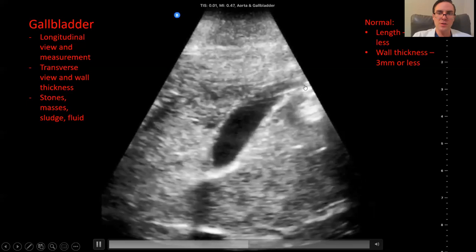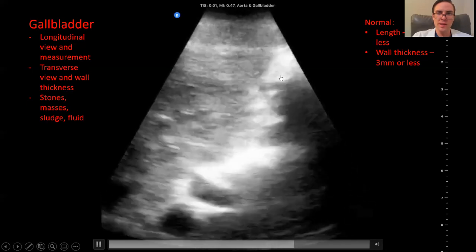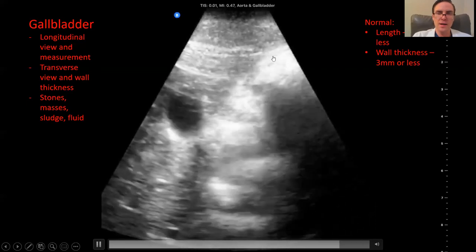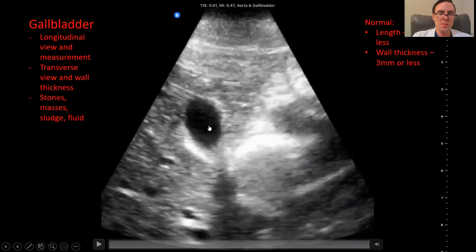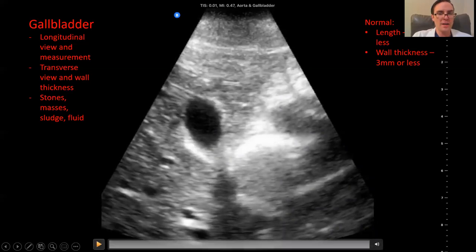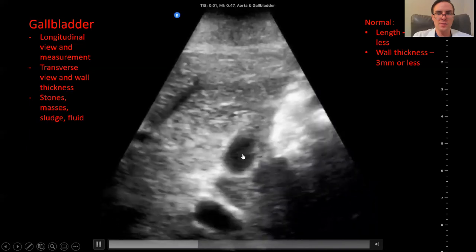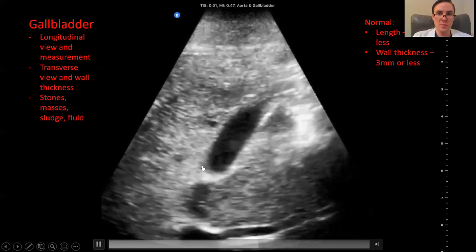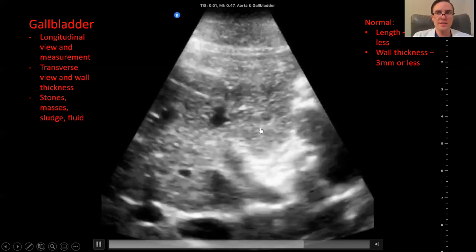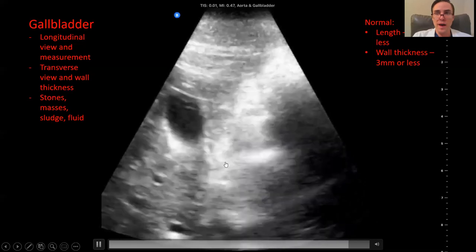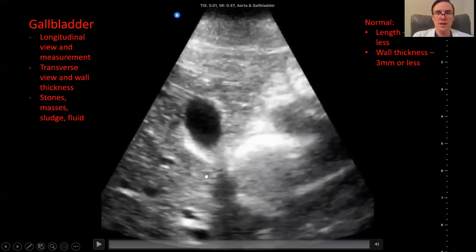The gallbladder is an elongated organ — round on the transverse view and elongated, like a banana, on the longitudinal view. You want to get both measurements. On the transverse view where it looks circular, you can measure the thickness of the wall — you want to make sure it's three millimeters or less. Then you also need to get a longitudinal measurement by turning the probe 90 degrees to see the whole gallbladder at length, measuring from end to end — you want that to be less than about 10 centimeters. More than that can indicate distension or inflammation. You're also looking into the lumen for stones, masses, or sludge.